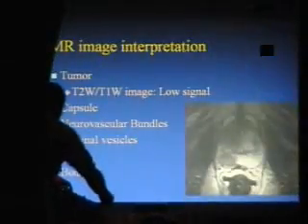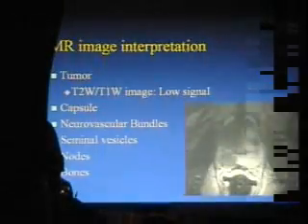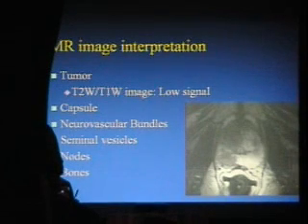And one thing about prostate cancer is it's never unifocal. It's almost always multifocal. About 70% of the time, they're little tiny foci that are all over the place. So we're not going to find probably all the cancers in everybody. But the index lesion, as I call it, or the dominant lesion, is the one you should find.